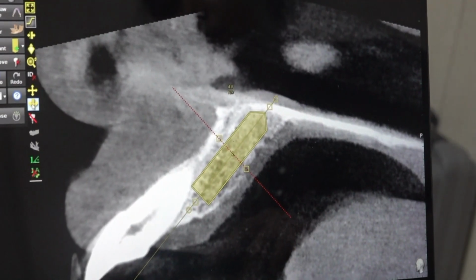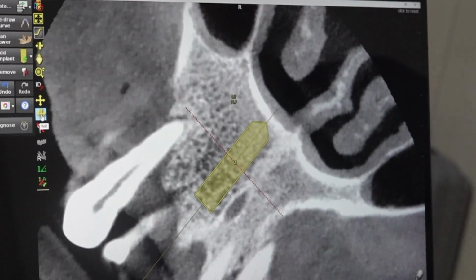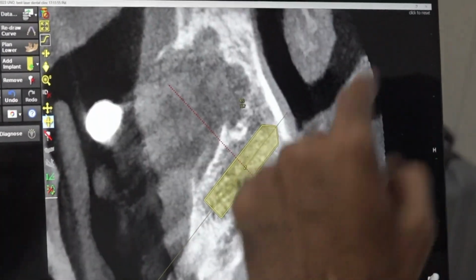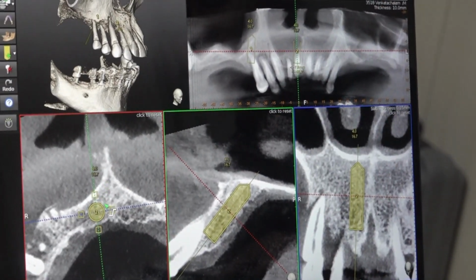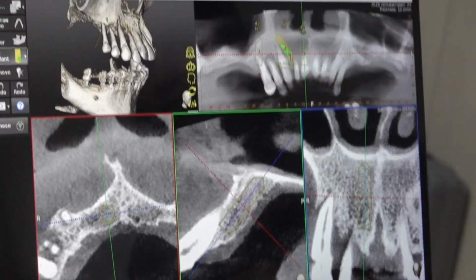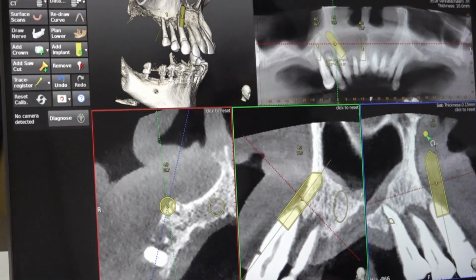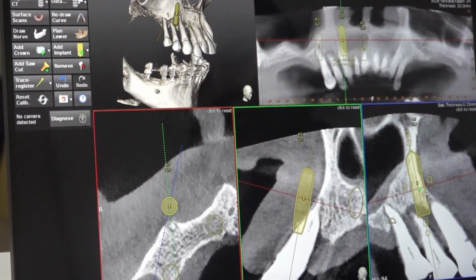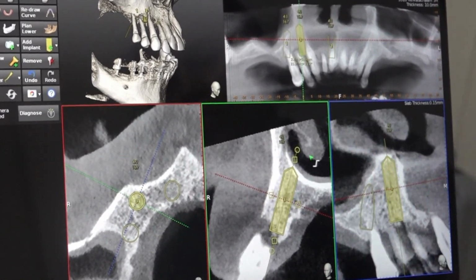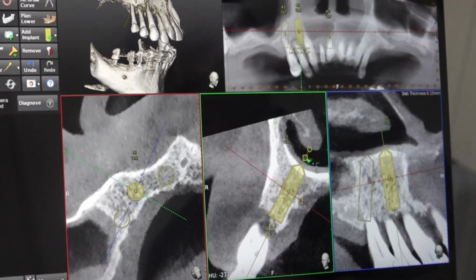Okay. So we'll see the 360 degree how it looks. Okay. So you have to see the canal. You can see the incisive canal. It is also safer. Okay. Now we are placing another implant in the first premolar. Okay, you can see till the apex there is bone loss, but fortunately beyond the apex of the premolar you have got some good, nice bone.